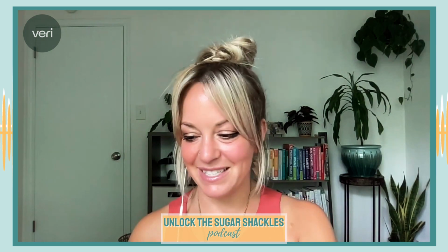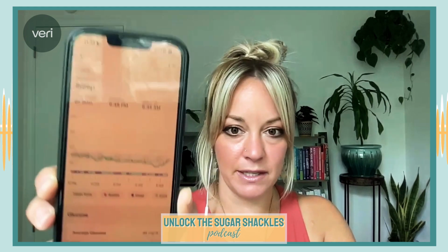Okay, so the app is so cool. And one of the things that it does is it will overlay your sleep data. I'm opening it up here so you guys can see. If you have an Aura ring, it will overlay that data with your wake up data. So here, let's see, April 20th. Let's go to my sleep scores. So I'm opening this up in my phone. So if you're watching this on YouTube, you can see. So here's the overlay. I'll explain this to you guys.